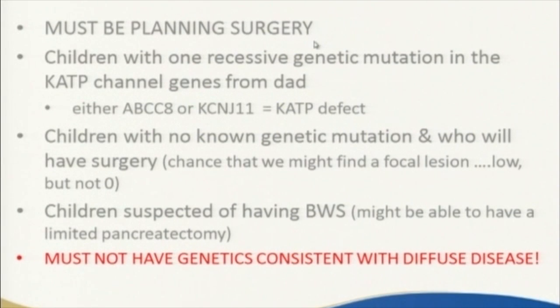So what are the benefits from having a PET scan? First of all, you have to know that you are going to have your child undergo surgery. Okay, we try not to enroll patients that aren't going to have surgery, but you must be planning to have surgery. We have all of our children genetically tested prior to the PET scan to make sure they have this potassium channel defect with an abnormal gene from dad.